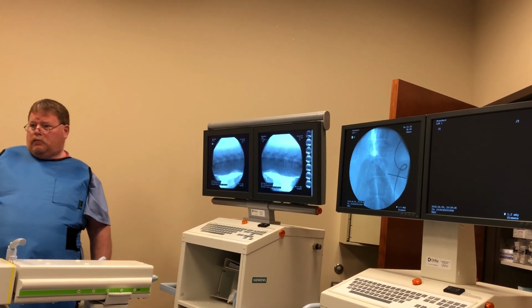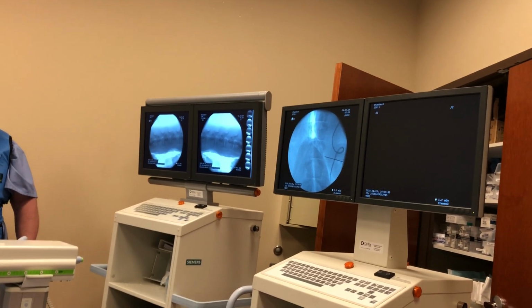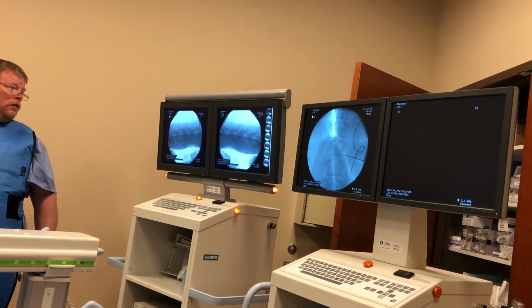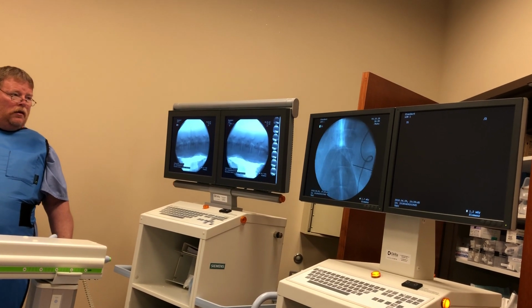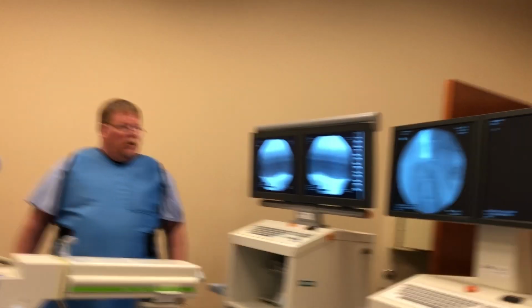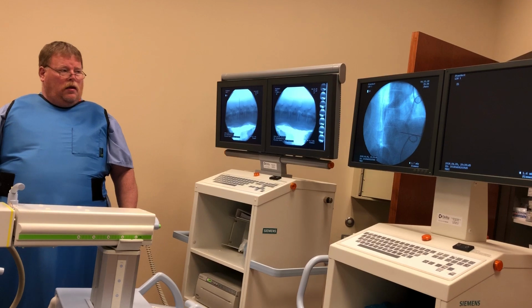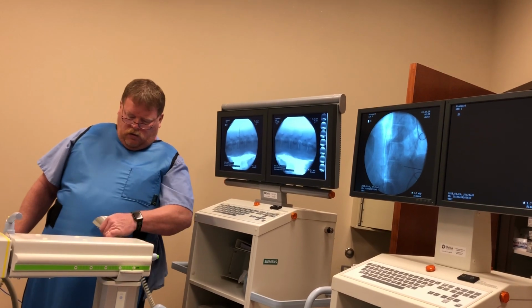Now you see the pedicle is closer to the superior end plate, but still not exactly at the superior end plate. Again. Okay, we are getting there. That's it. Get the AP. Okay, now open the back two of the AP. Again. Lock the back two. Okay.